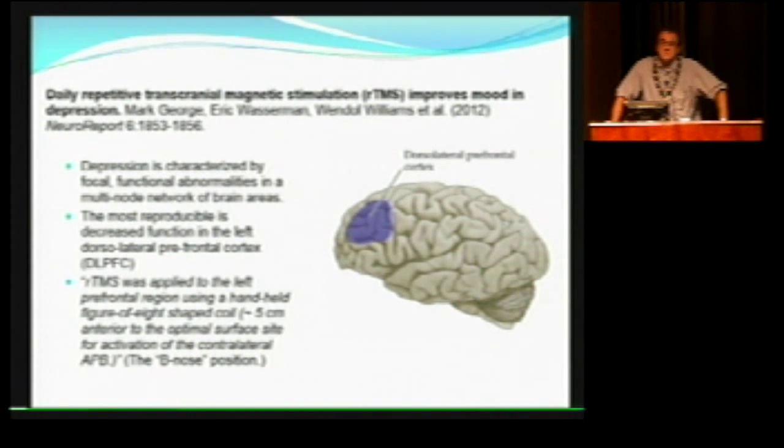and that ought to do it. It's like, wait, that assumes that you have another sulcus that's oriented just like the central sulcus, 5 centimeters in front, which you don't, right? So that's a bad idea. On the other hand, it worked reasonably well, and I think one of the reasons it works really reasonably well is that the gyri are all really confused. So you're going to hit something, and it will be within DLPFC.